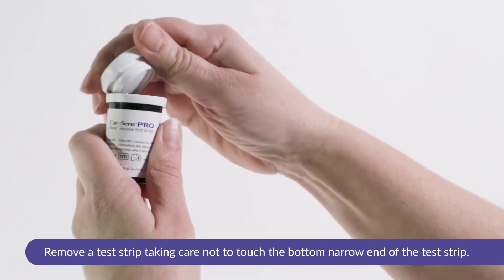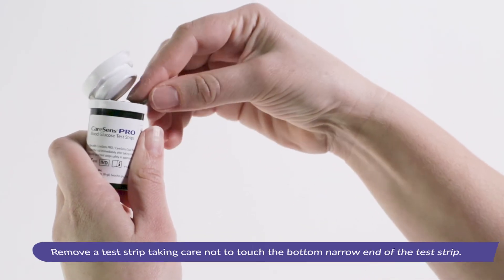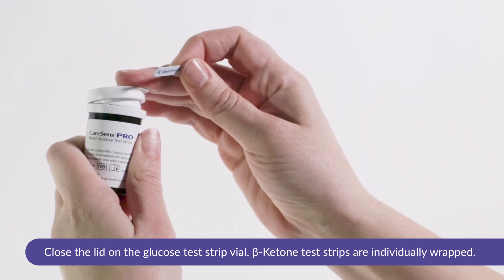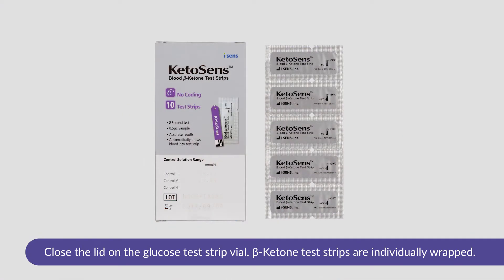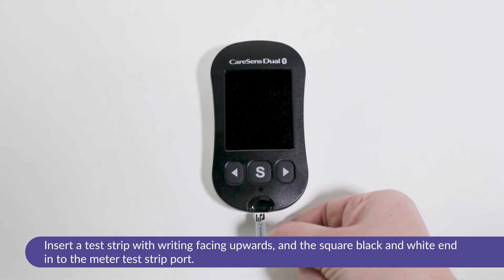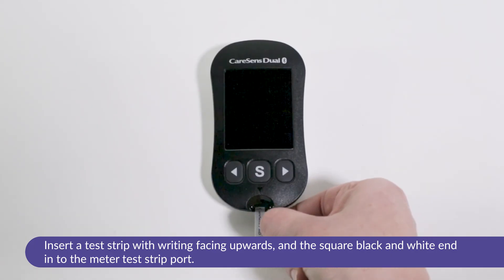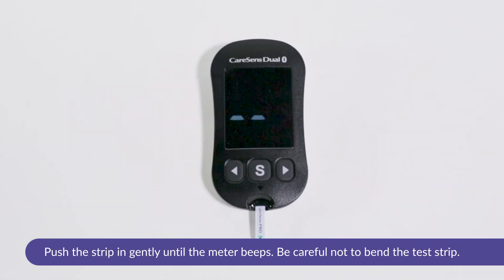Remove a test strip taking care not to touch the bottom narrow end of the test strip. Ensure you close the lid on the glucose test strip vial. Beta ketone test strips are individually wrapped. Insert a test strip with the writing facing upwards and the square black and white end into the meter test strip port. Push the strip in gently until the meter beeps. Be careful not to bend the test strip.